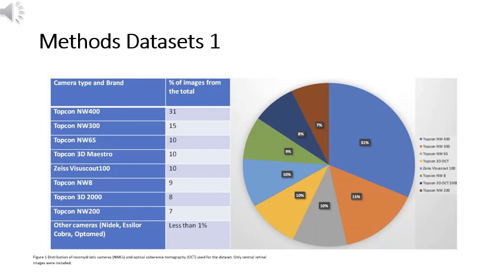Since Optretina performs screenings, patients in whom pathology is detected are subsequently referred to ophthalmologists. Repetition of images of the same patient is very rare. It is estimated that 0.5% of the dataset images may be of patients already assessed in previous years.